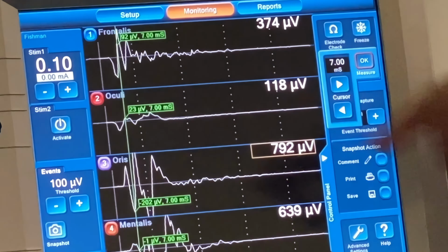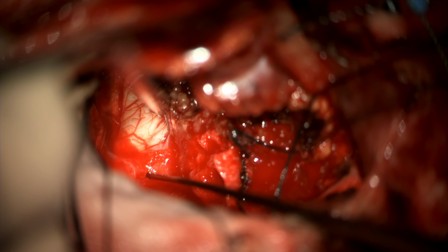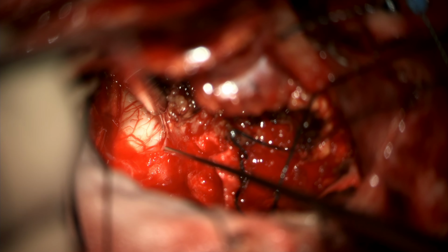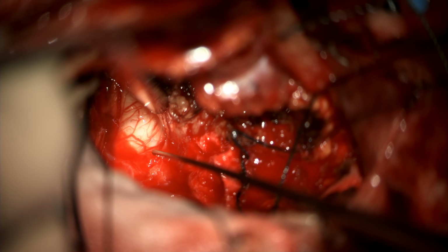And that's why we're able to get that level. Okay? Good. Go ahead. Again. Good. Gently. And there. Go ahead. What about that band? That band, is that something? No, it's not. Okay, but that's capsule, so we're going to leave that down.